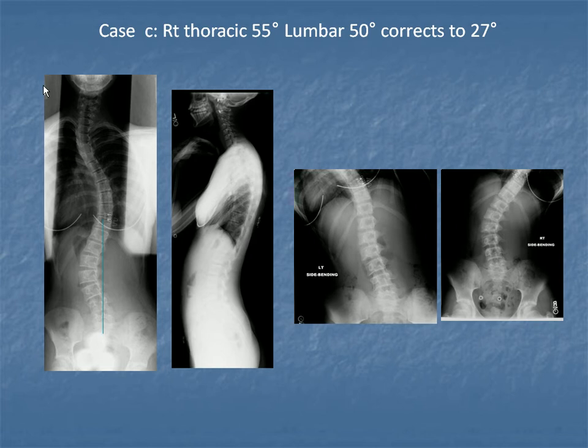This patient corrects to 27, 25. You can read it as 1C or 3C, but it's C. And side bending is reasonably flexible. It's calculated as 27, but could be 25. The number is not really the issue, and I'm going to present what I propose for this. It could be 25; you shake your hand, make it 23, so it will be below the 25 marker. But the central sacral line is far away from the apical vertebra.